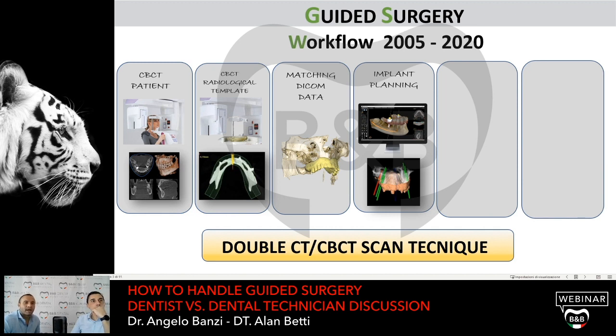With the surgical software, I'm going to decide the perfect position of the implant, guided by the radiological template. That's why Alan mentioned that it's important to have the shape of teeth in the radiological template, because I'm going to have very important information, I would say gold information, because it's the only way to understand in which position I'm going to place the implant.